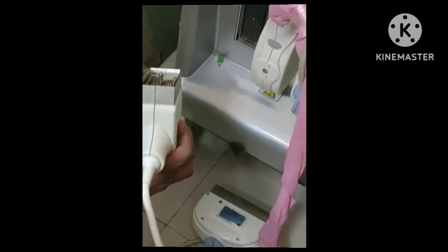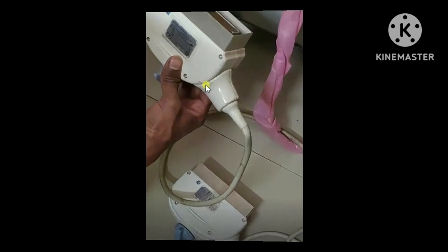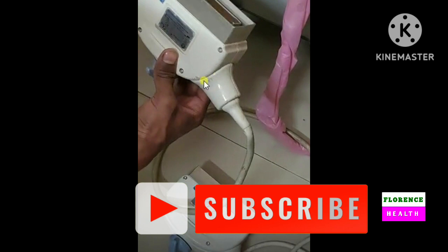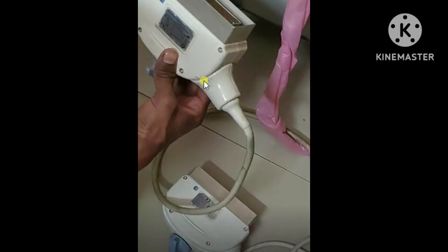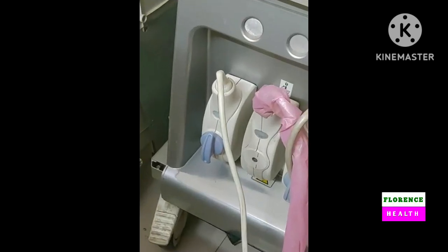Again the same process. The old probe is taken out from the port side. Now selection of a new probe which is to be fitted to that port side. The new probe is connected to that port side by clockwise rotation of the knob and tighten the knob.